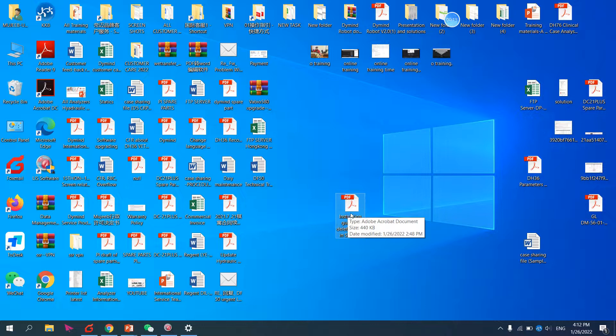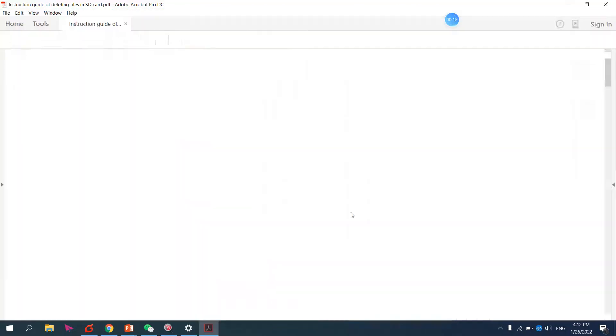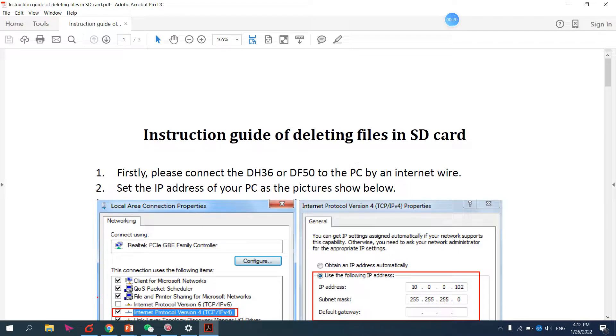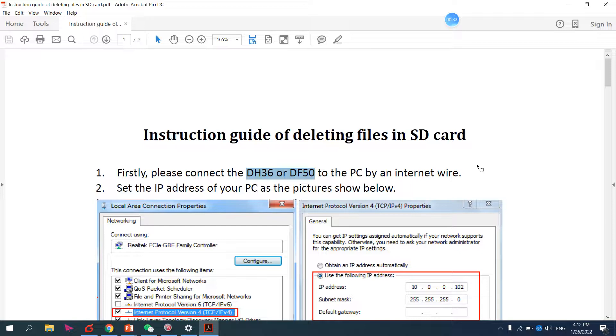First, you must have this instruction PDF file. This is the setting. First, you have to connect your PC or laptop with the analyzer. This is for the DH36 and DF50 analyzer.